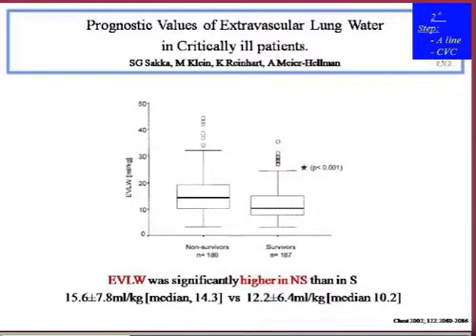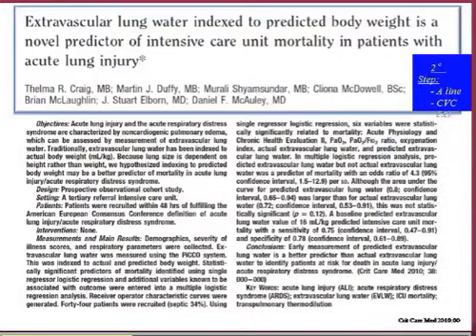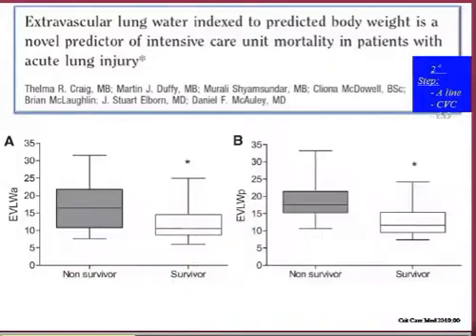And remember extravascular lung water. Sakka wrote this paper in a retrospective way, but the total amount of extravascular water is able to give you the mortality or not. The higher is the number, the higher is the incidence of mortality. And this paper that I show you, because it's a 2010 paper, again, yeah, it's the future. The extravascular water, according not to the body weight but to the height of the patient, because the lung depends on the height, gives similar results. The higher is the value, the higher is the mortality. So I think it's important to remember this target.